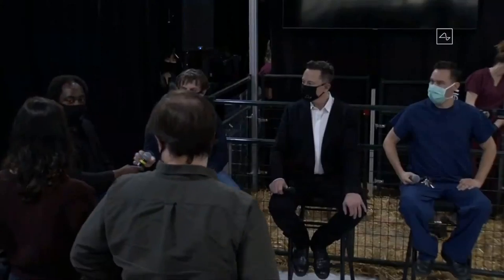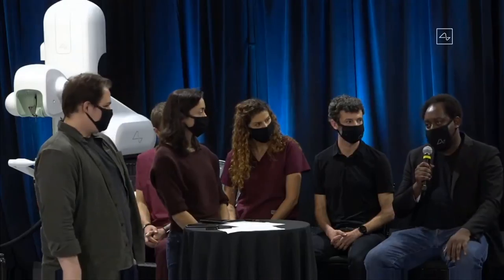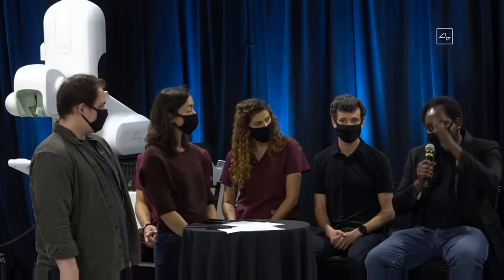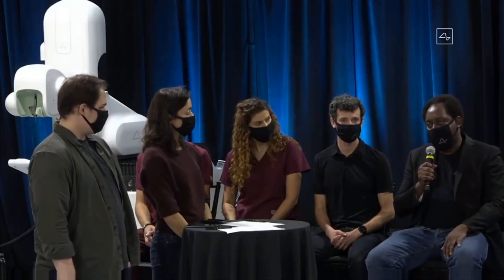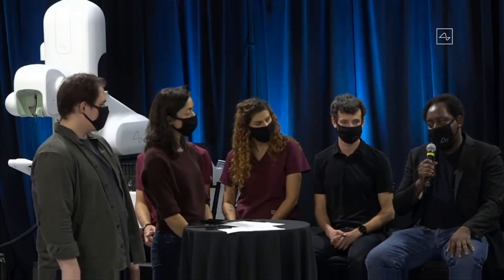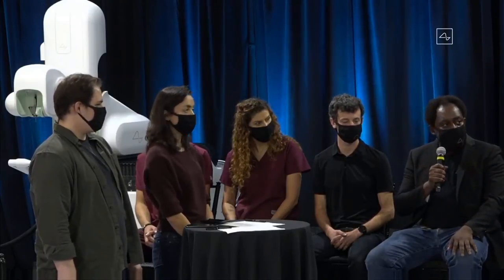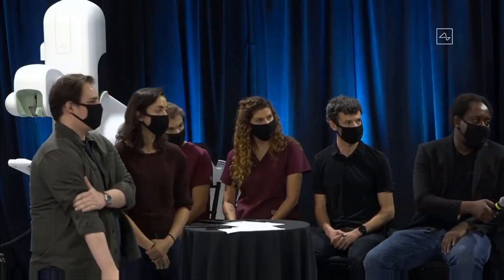And when you guys say thin, how thin? So one strand of your hair is about 100 microns in diameter. We can think about dividing that into 20. So one of the thicknesses that we have is about 5 microns, and we have the possibility to go even thinner in the near future. Yeah, we think we can probably go sub-micron in thickness, but obviously the thinner you make the wire, the harder it is to sense the signal and to do stimulation because there's less cross-sectional area for the current to traverse.